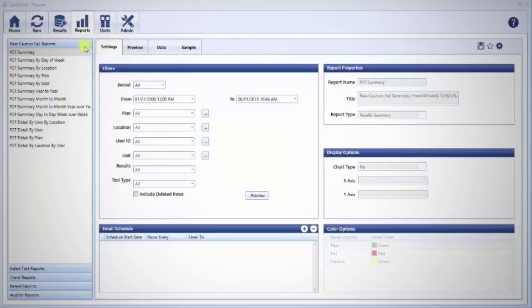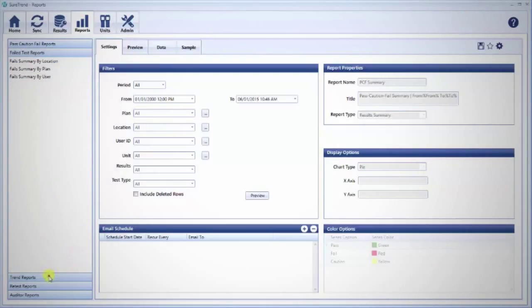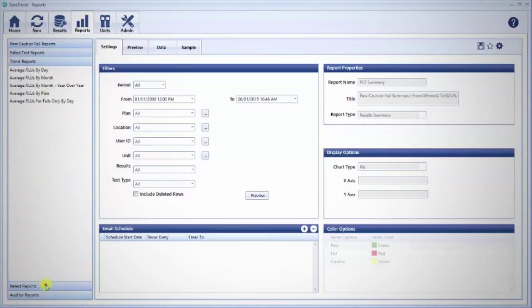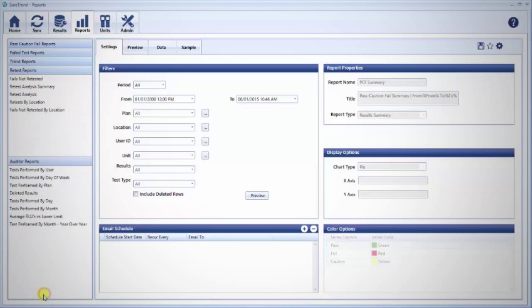SureTrend comes pre-programmed with over 30 reports, but the possibilities are nearly endless. If you have an idea for a report that you did not see in SureTrend software, contact your Hygiena representative for help customizing a report.